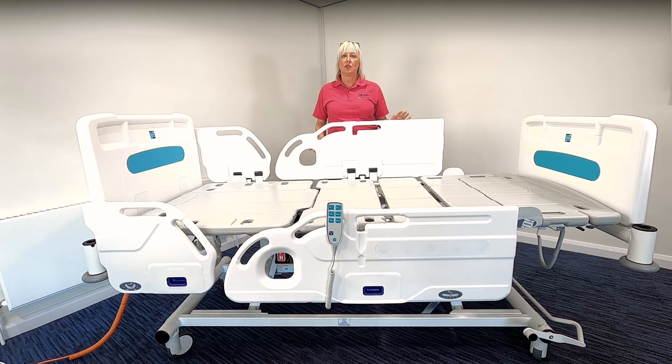It's very important to refer to the full user manual instructions that come with the bed to identify any contra-indications for use, for example unstable spinal injuries. It's also the responsibility of the prescriber to carry out the necessary risk assessments required, and this is not limited to but will include falls, entrapment, and the use of side rails. It's also important to refer to your local policy and equipment selection guidance.